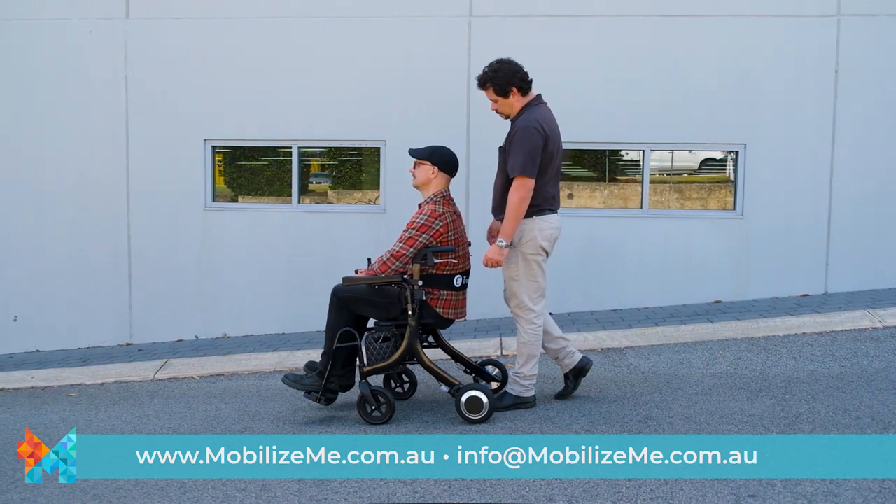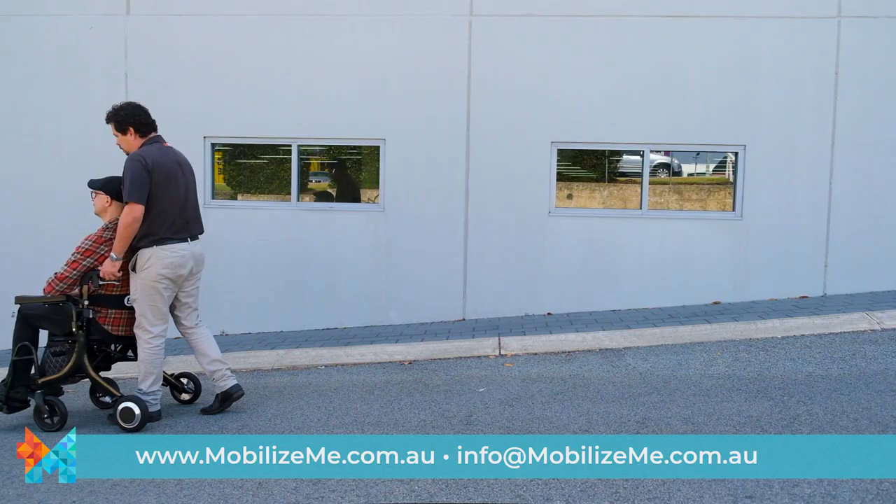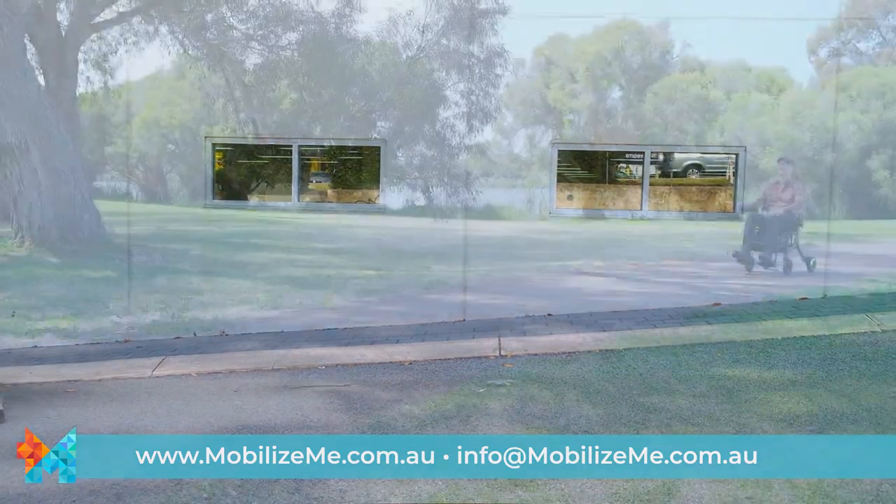An attendant can easily use the push-assist function or the fully-powered function to guide the Evo and its passenger along.